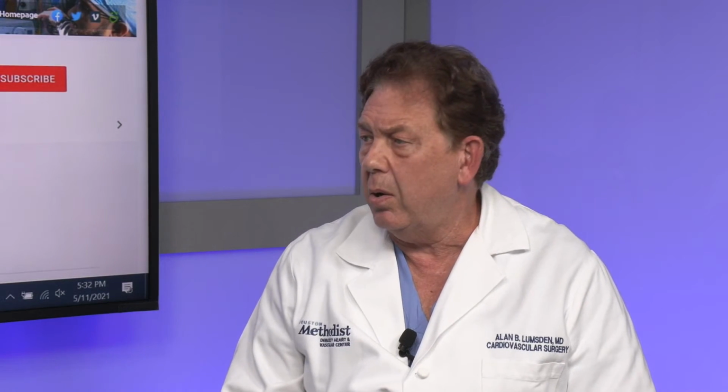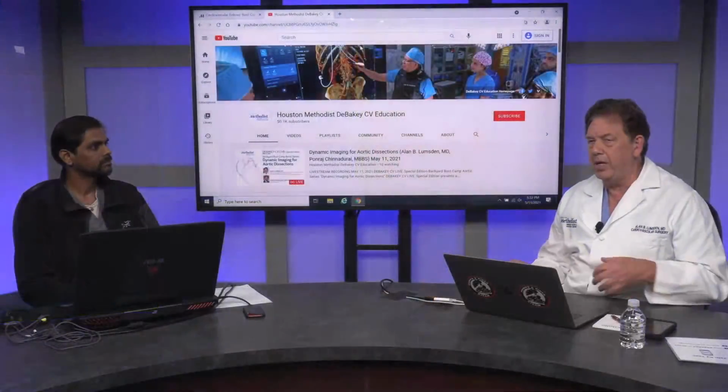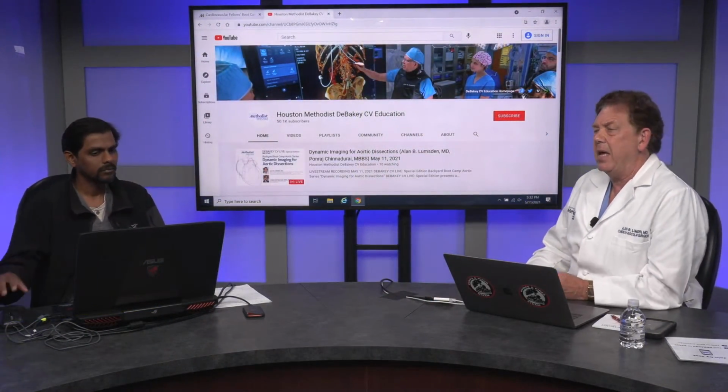We've been showing pictures of dynamic MR for years, and all we get is, well, not everybody can do this. You need people who are vested in creating these sequences and dedicated techs to be able to do it. That's true. It's a lot more labor intensive to get images out of it. We're excited about both, to be completely honest with you, but we realize that dynamic CT can be generalized a lot more easily than dynamic MR.